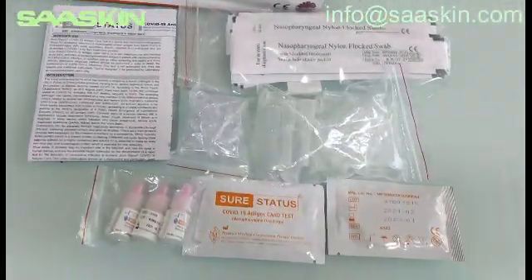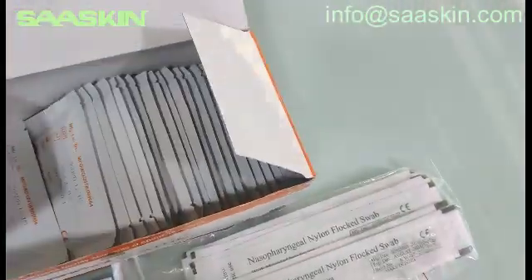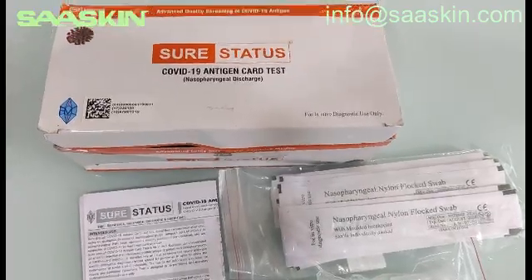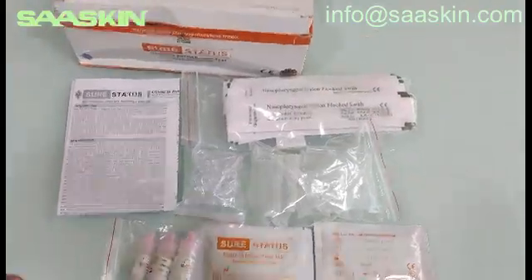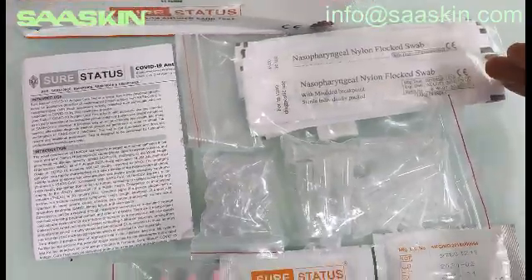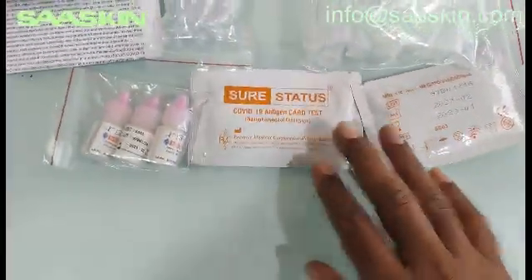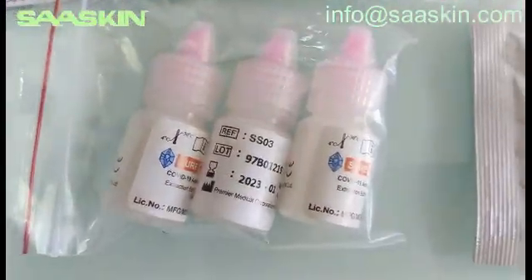Just a quick summary: the SureStatus COVID-19 Antigen Test Kit is CE certified, ICMR approved, and WHO approved. This box contains an instruction manual, 25 nasopharyngeal test sticks, 25 extraction buffer tubes, 25 nozzle caps, 25 test cassettes, and three bottles of buffer liquid.